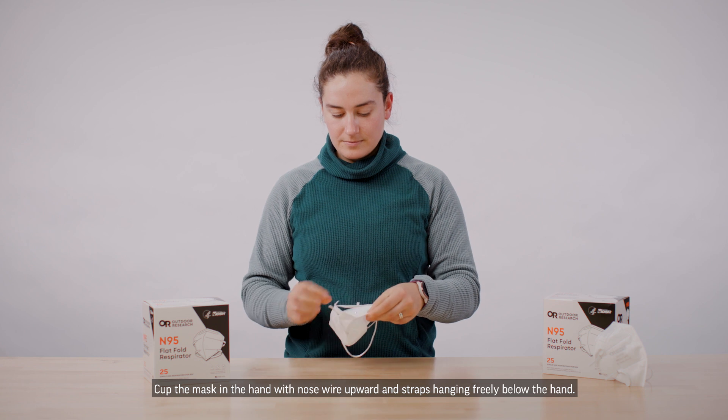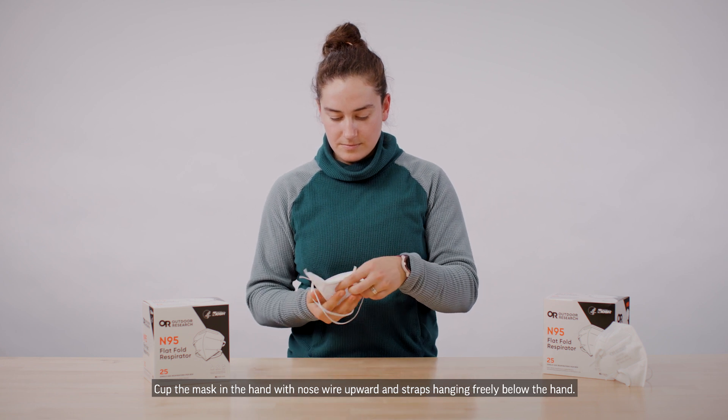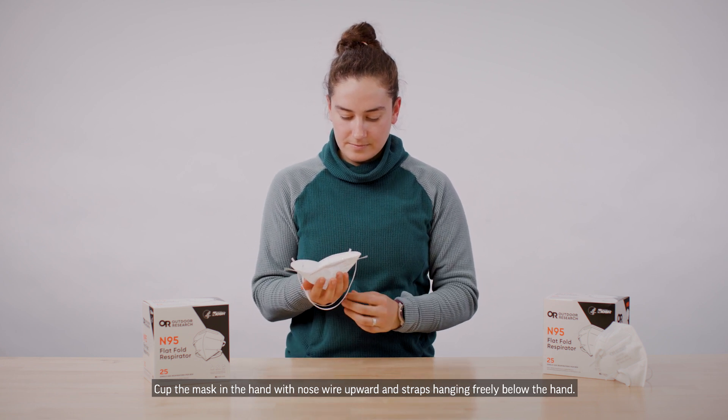Step 2. Cup the mask in the hand with nose wire upward and straps hanging freely below the hand.